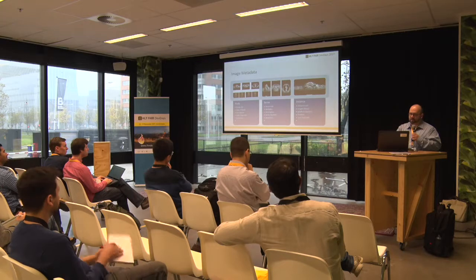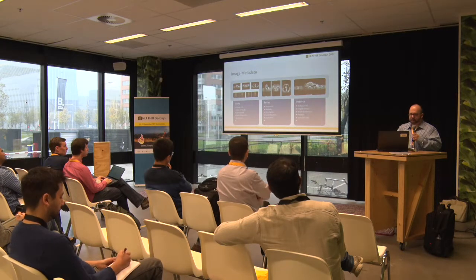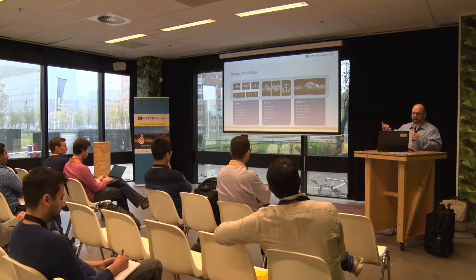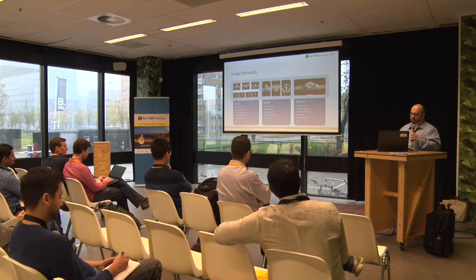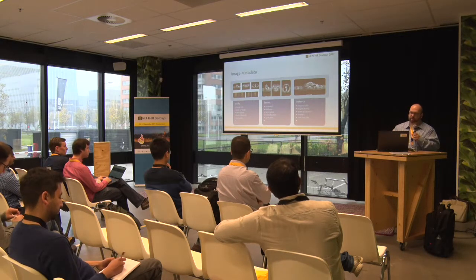Each of these DICOM instances has its own set of metadata. These are DICOM tags, like the identifiers, the date of the study, the description of the study. At the series level, we have the modality that was acquired from, the description, the series number, and the instance has, again, its own set of metadata as well, like the height and width, the position, the type of object that it is.